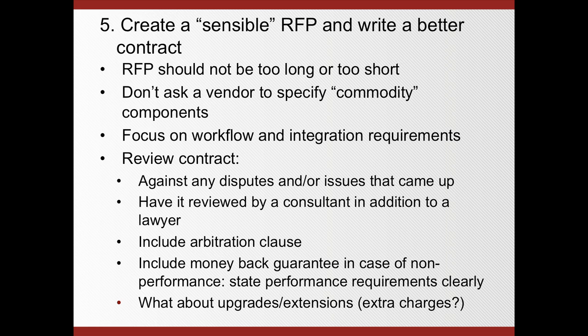With regard to the contract as well, it's very likely that you have had questions or things that occurred that you thought would be covered by the vendor, or that you want to do differently. So take the opportunity and look at all the issues and disputes that came up, and this time do a better job of covering that in the agreement. And then, even if you don't necessarily hire a consultant for the RFP process, as a minimum I would suggest getting a consultant for the contract.